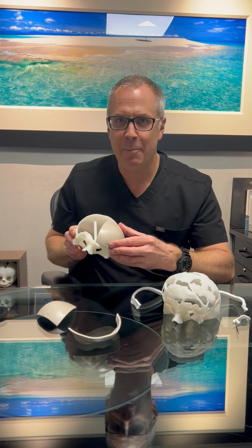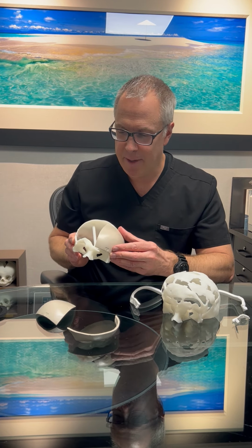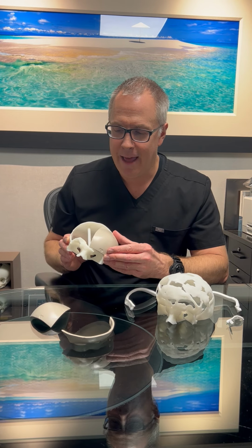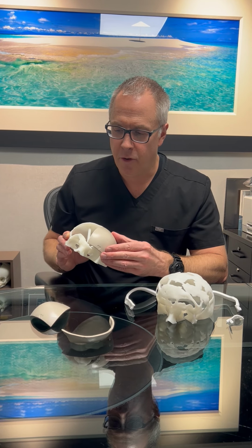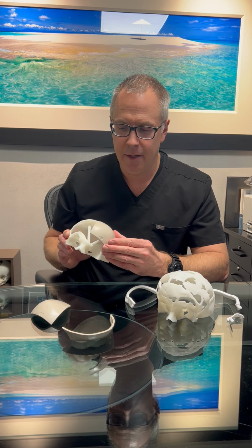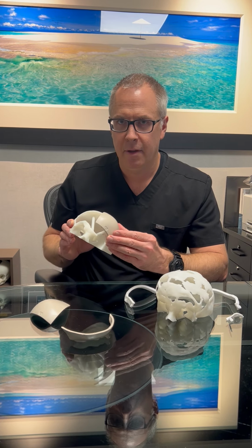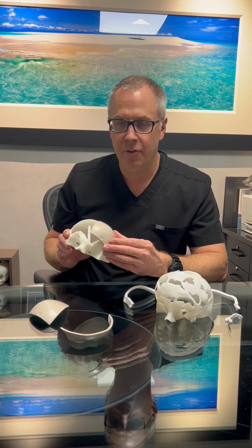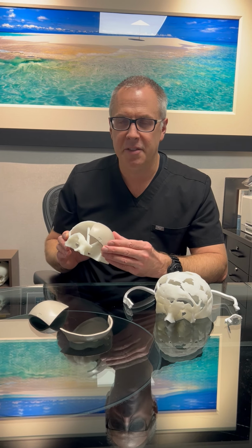So this is an example of technology being used, first of all, to come up with a surgical plan, and then also in order to create anatomically perfect synthetic implants to be used in the reconstruction of this 9-year-old skull.